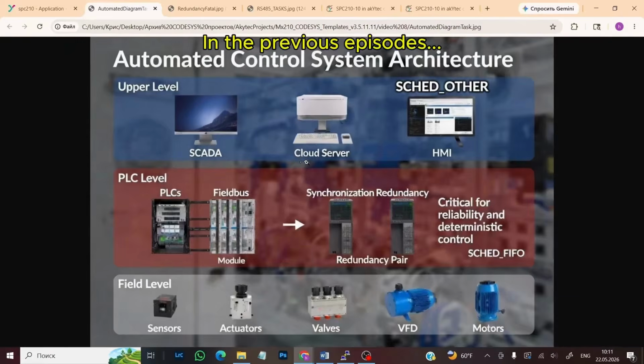PLC tasks that provide communication with the upper level, such as cloud, HMI, and SCADA, are configured as less priority tasks, and PLC tasks that provide communication on industrial buses with I/O modules and field devices, which also provide PLC redundancy, as well as a user task that controls field devices, are high priority tasks, or in other words, important tasks.